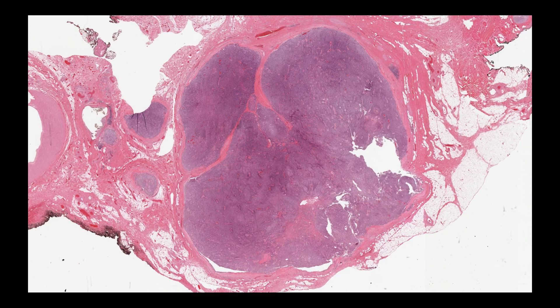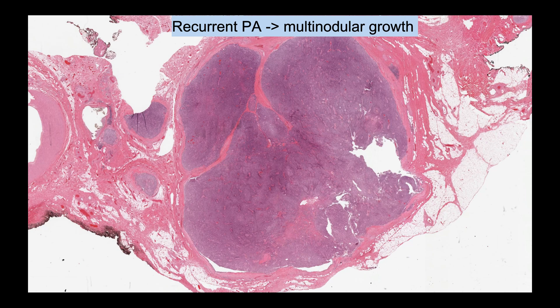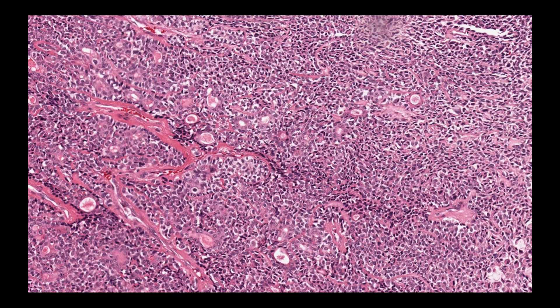This is an example of a recurrent pleomorphic adenoma. In recurrences, a multi-nodular growth pattern is typical — here we can see at least four nodules of different sizes. This case also shows a predominance of the cellular component, making it a so-called cellular or highly cellular pleomorphic adenoma. Reaching the correct diagnosis in such cases can be challenging, so proper sampling to identify areas with the characteristic chondromyxoid stroma is very helpful.